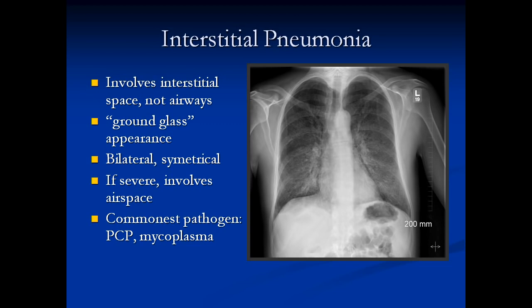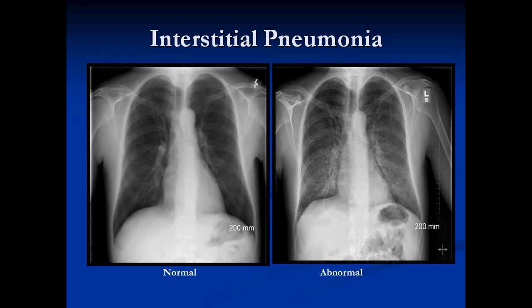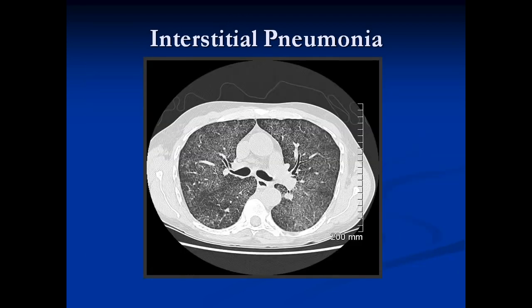If severe, the interstitial pneumonia can go on to airspace disease. These are called atypical pneumonias, and the commonest pathogens are PCP, mycoplasma, viruses, and other atypical pathogens. Here we have a normal alongside a very early interstitial pneumonia — sometimes it's extremely difficult for the clinician or emergency doctor to tell whether there's interstitial disease or not, and it's very helpful to have a previous film for comparison. We see some very mild interstitial changes. Later on, you have the bilateral symmetrical ground glass, sparing the periphery, with no silhouette sign — this is an interstitial pneumonia. On CT scan it just looks like ground glass everywhere.